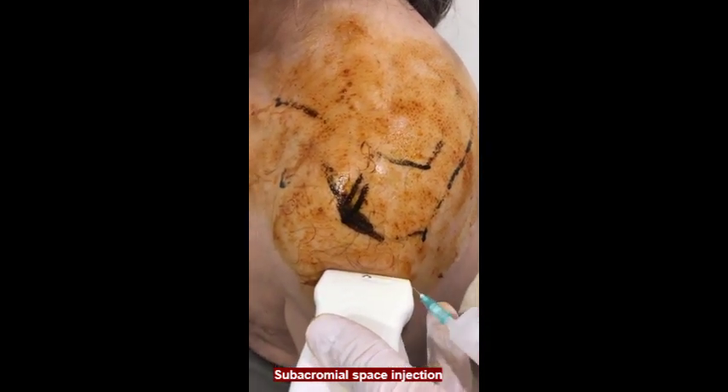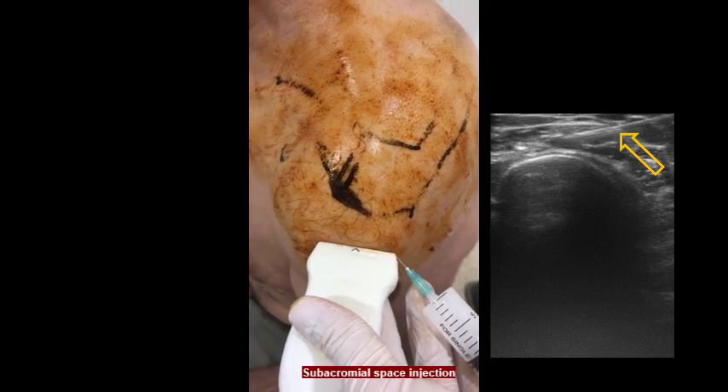10 ml of the drug combination is injected into the subacromial space.